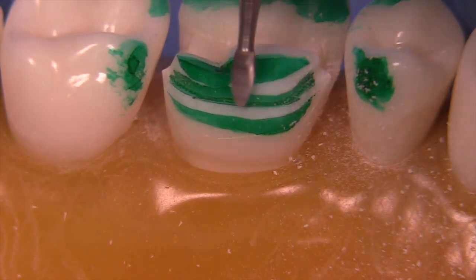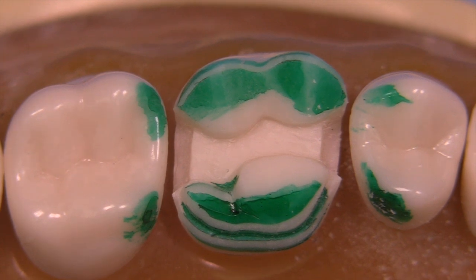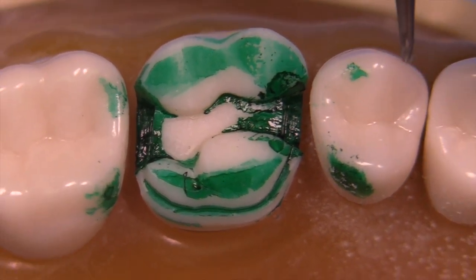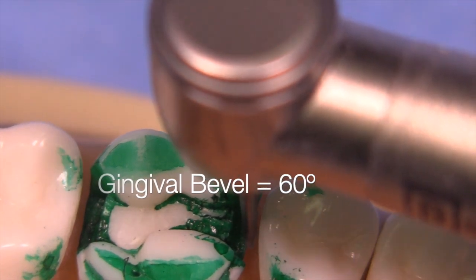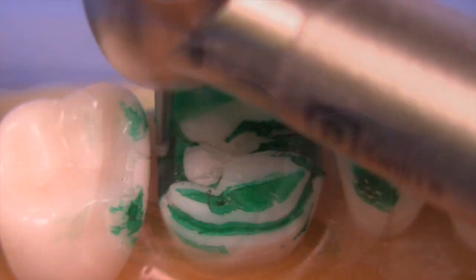Notice that the burr is also trimming the functional cusp while creating the bevel — I think this works out quite well. We're now ready to place the gingival bevels, and for this I'll use the H248S carbide. This carbide has a 60-degree downward inclination so you can create a nice slip-joint bevel of 60 degrees. Use the side of the tapered portion of the burr back and forth to do the bulk of the work, then repeat the process on the distal.